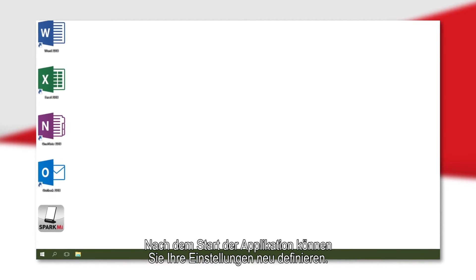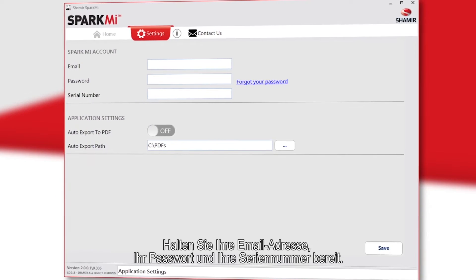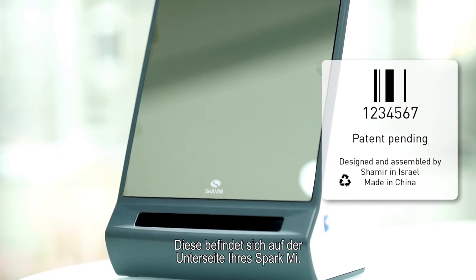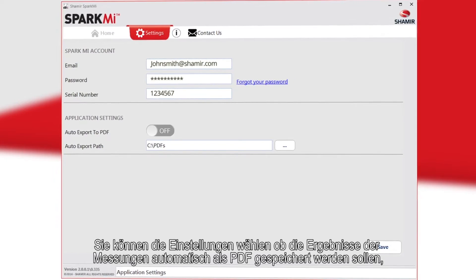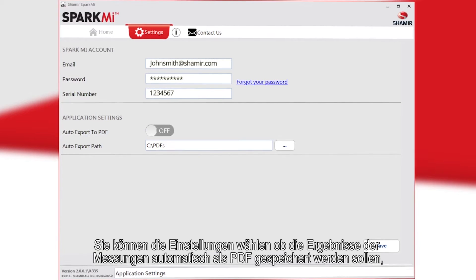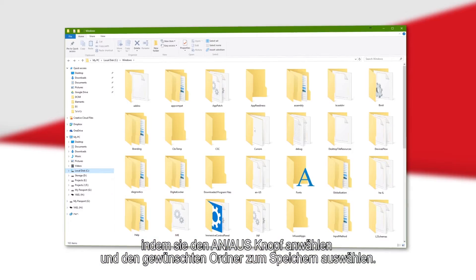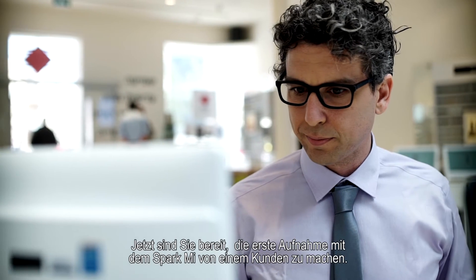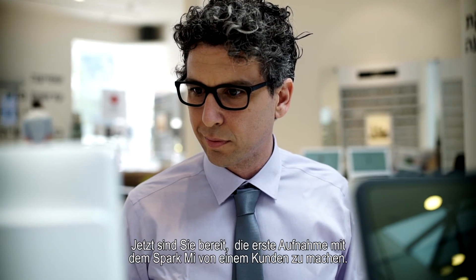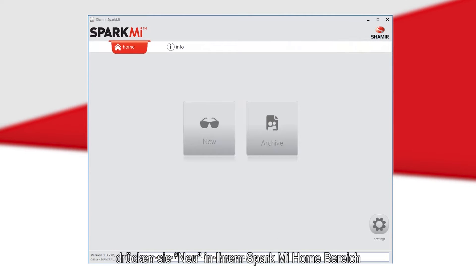Upon launching the application, you will be able to define your app settings. Provide your email, password, and product serial number, which is located at the bottom of your SparkMe device. You can elect for the system to automatically save patient measurements as a PDF file by clicking the on/off button and choosing the directory. Once selected, click Save. To access the patient photo screen in the future, hit New on the SparkMe home screen.